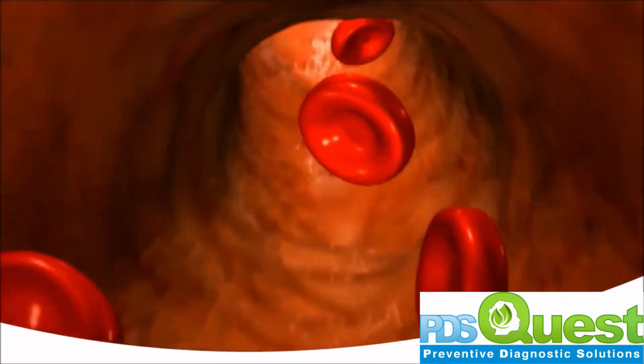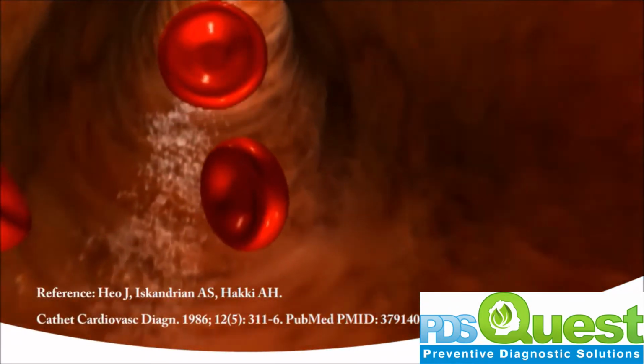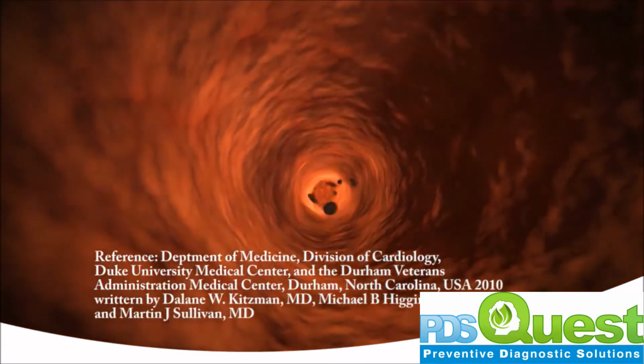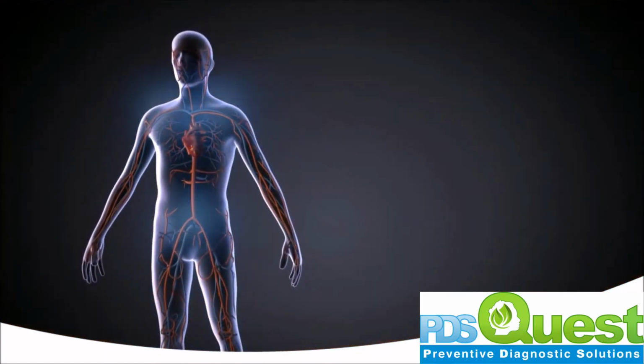arteries. There is a significant relation between left ventricular diastolic function and exercise tolerance in patients with left ventricular dysfunction, and exercise intolerance in patients with heart failure, and preserved left ventricular systolic function. Pulse wave velocity is measured by the finger probe.